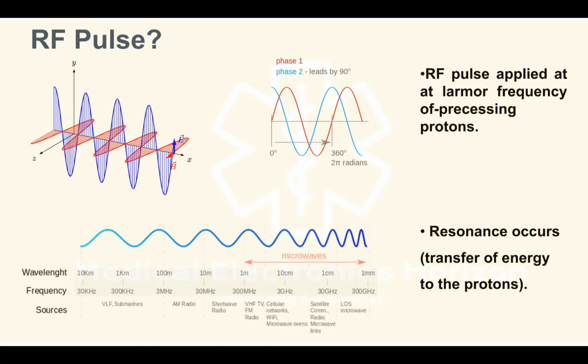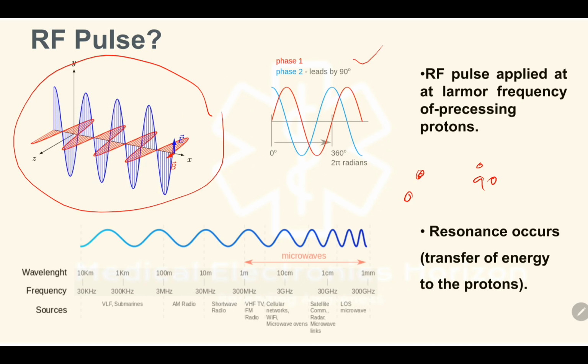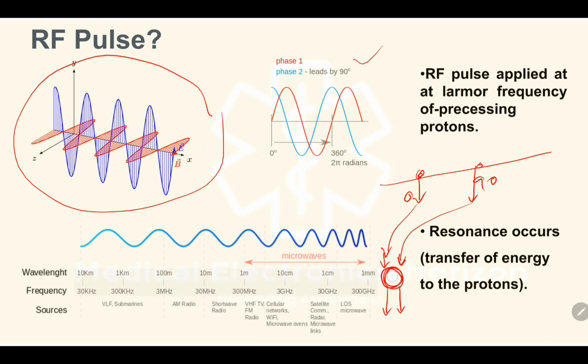Another image is about the RF pulse. As I explained in my previous slides about RF, two sinusoidal waves, an electrical wave and a magnetic wave, propagate together with a shift of 90 degrees. Here in MRI we are using two nodes, 0 degree and 90 degree split. We are transmitting through two different channels to the transmitting coils. In the next slides you will see this is your body coil. Some companies say body coil, some say transmit antenna. This transmits the RF signal to the patient.